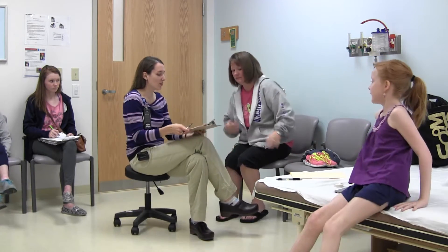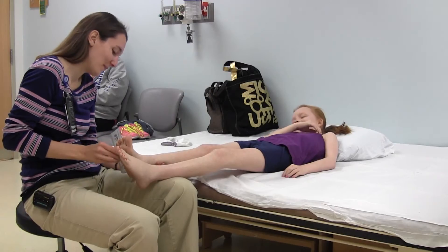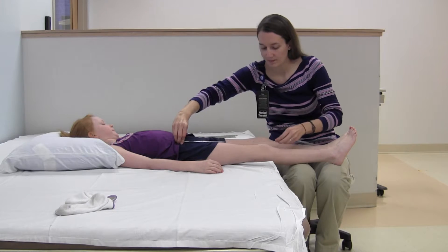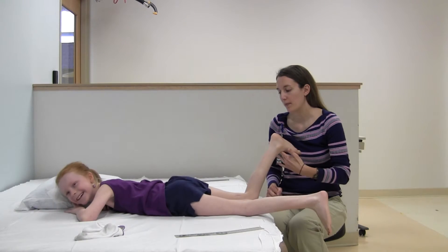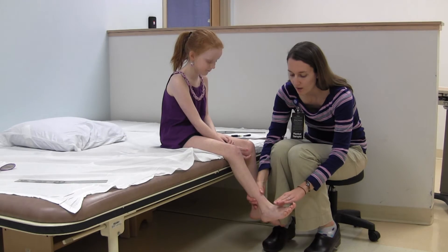The physical therapist, or PT for short, will talk with my caregivers about how I move and walk. The PT uses a special ruler to measure how my legs move, and a tape measure to see how long my legs are. The PT will ask me to move my legs and measure how strong my muscles are. I have to lie on my back, on my stomach, on my side, and then sit up.